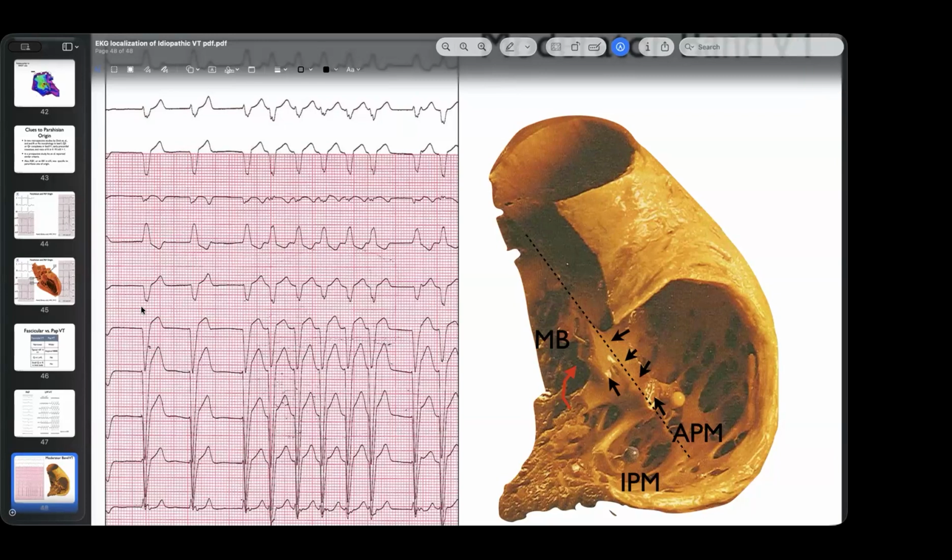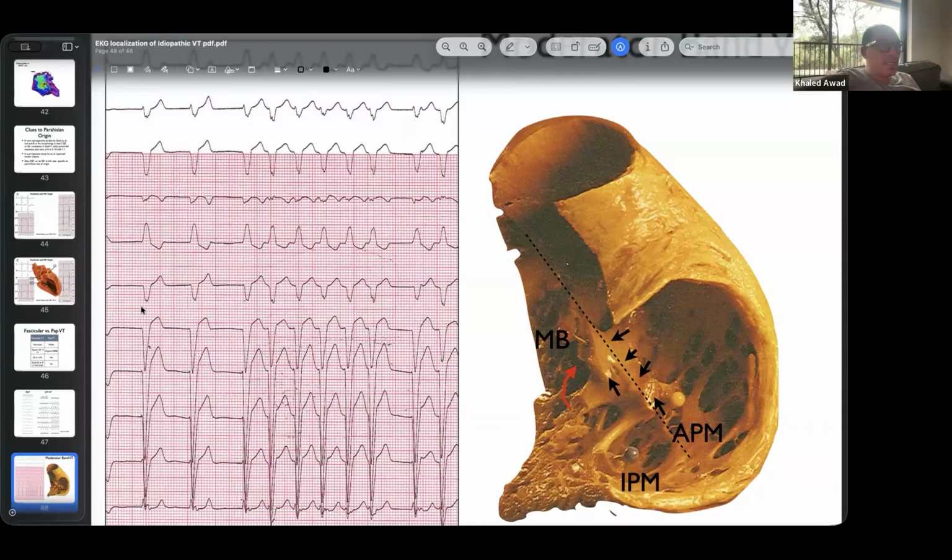Do you use a steerable sheath or a normal sheath? No, you don't need a sheath at all. I actually think using a sheath there is just asking for trouble. I think you're giving yourself the ability to put a lot of force on the wall. I think the sheath actually makes it harder to maneuver because it commits you in one direction or another.